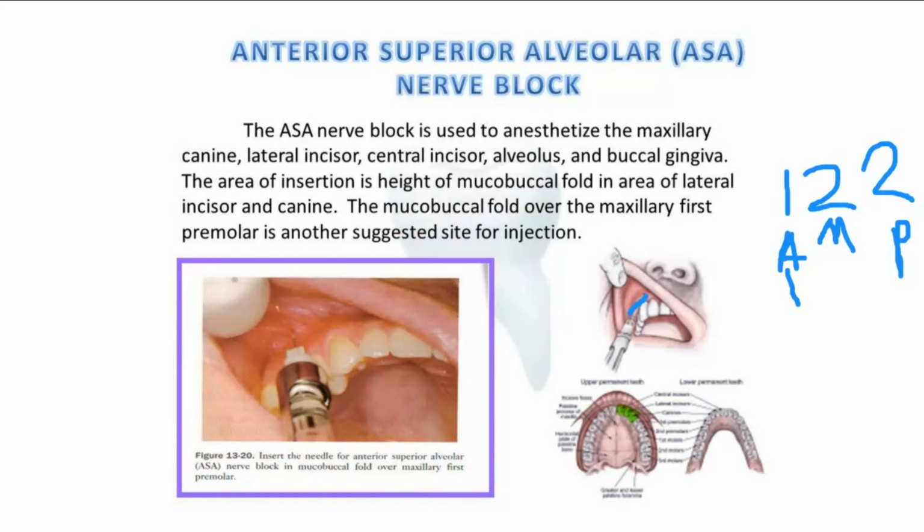By the way, just something for you to understand. Usually, you should give local anesthesia first, something that you put on a mucosa. It's a local agent that I think is lidocaine or something. I don't remember exactly, but you put it first, give the patient a minute or a couple of minutes, and then you start. This will make the first entrance less painful. It is painful, and it will be painful. Inserting the needle is painful anyway, but less painful is always good for the patients.